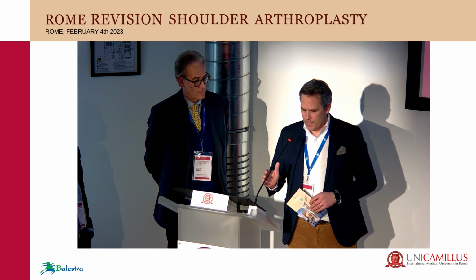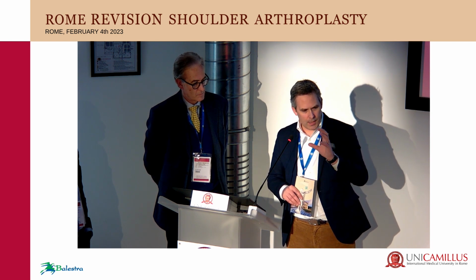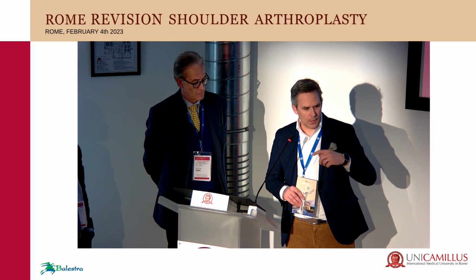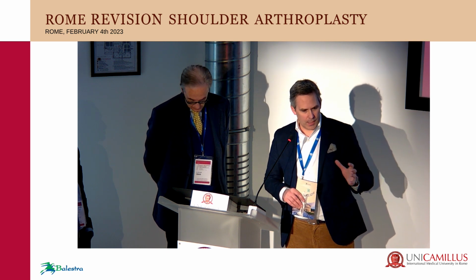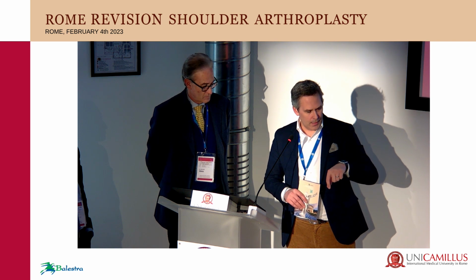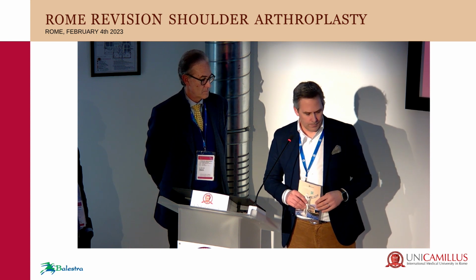Intraoperatively, I'm looking at it when it's reduced, and I'm taking them out into about 60 degrees of external rotation. I want to see tracking of the humeral liner without any gapping at all. If there is, then I'll go back and do more soft tissue releases, because it's probably impingement. If I do that and it's tracking fine, then I'm happy. And as long as I can't take it out with a finger, those are my two ways of checking. And if I can, then I'll go up on the liner.